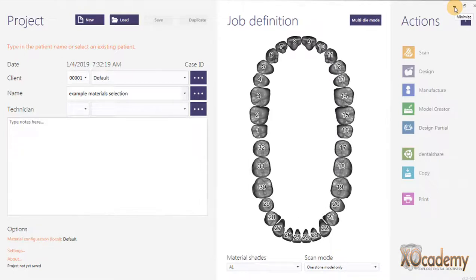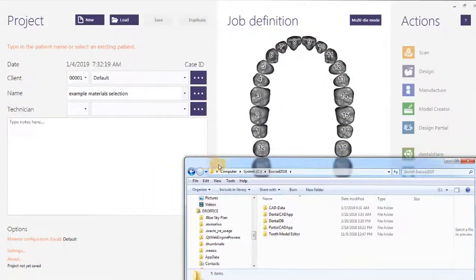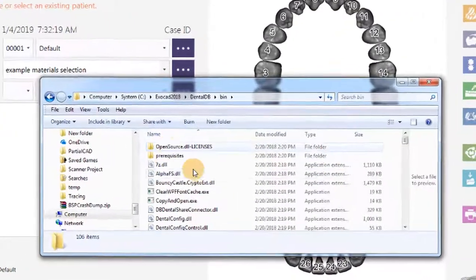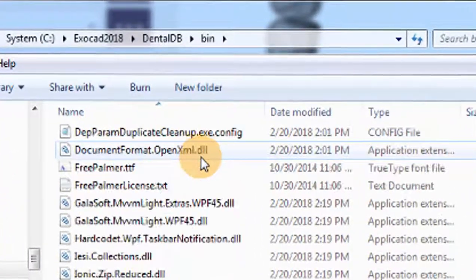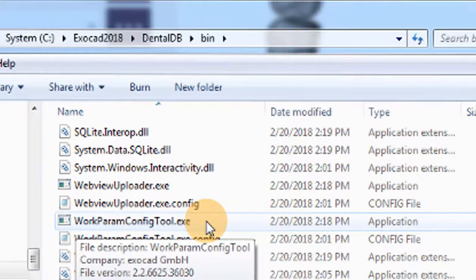If you want to change your default material configuration file, I'll show you how to do that. I'm not going to go into all the specifics of creating different materials, but I'll show you the area where you can do it. I'm going to go into my ExoCad folder here and drag this over. You can see I'm in my C drive, ExoCad, and I'm going to go into DentalDB, then Bin, and we've got the work_param_config_tool.exe.